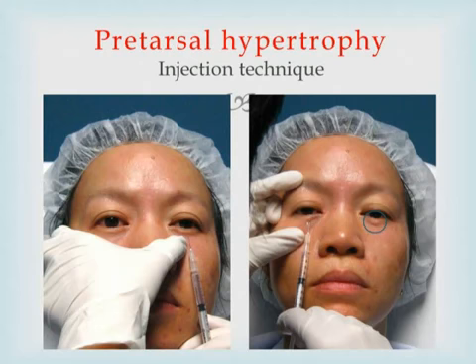The third injection site is the mid-pupillary.